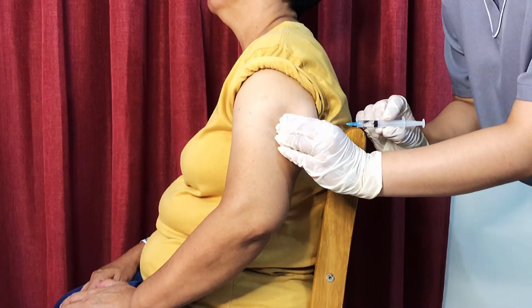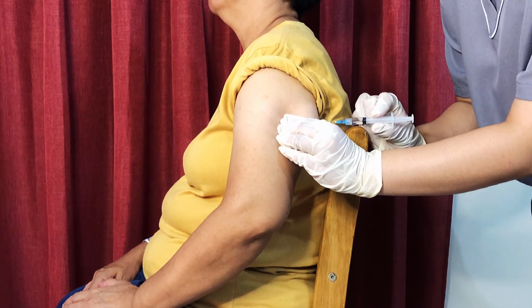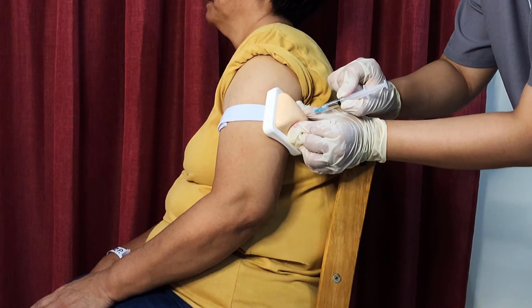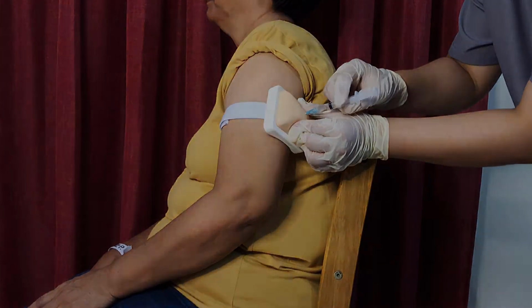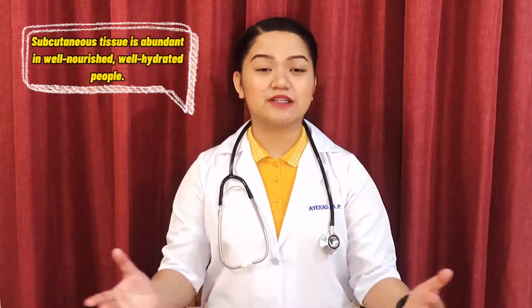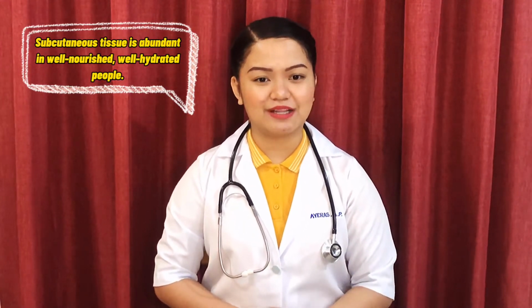And then hold the syringe in the dominant hand between the thumb and forefinger. And yes, insert the needle quickly at a 45 to 90 degree angle. Inserting quickly causes less pain to the patient. Subcutaneous tissue is abundant in well-nourished, well-hydrated people. For patients with little subcutaneous tissue, it is best to insert the needle at a 45 degree angle.